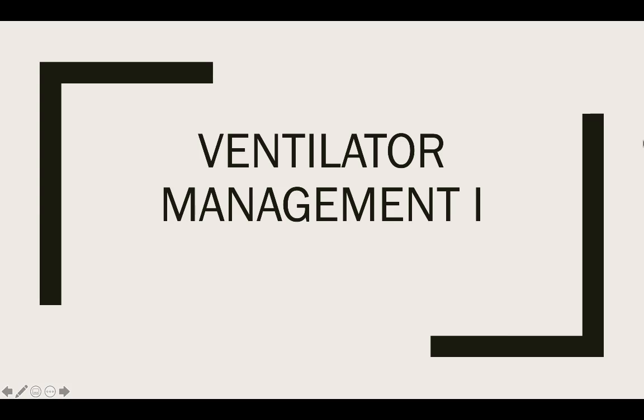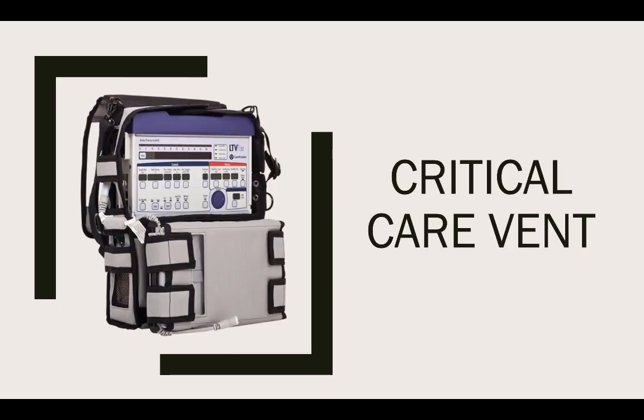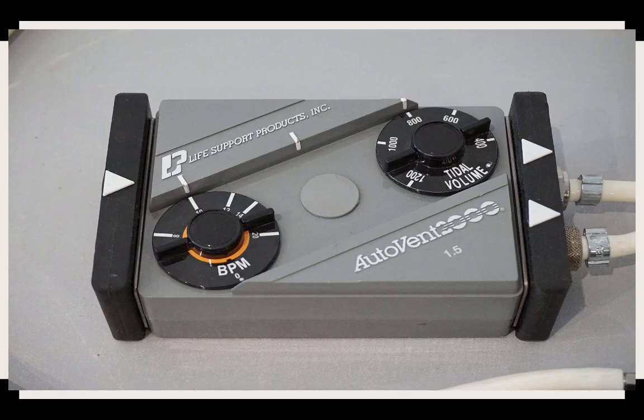Let's talk of ventilators. And the ventilators we're going to be talking about can be something like this, something with a lot of options, a lot of settings, a lot of functionality. Something you might see on a critical care truck, or even at your typical 911 service who does some interfacility transports.